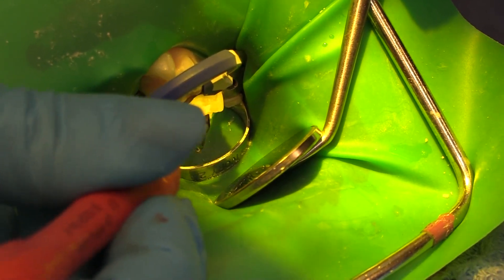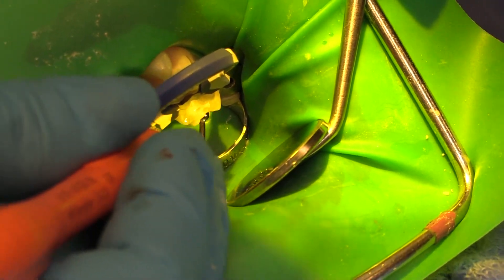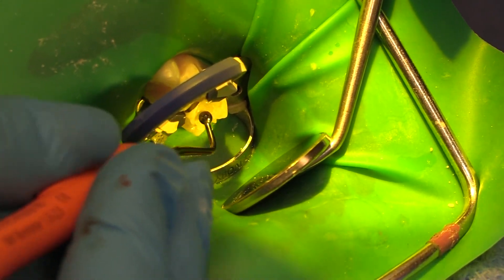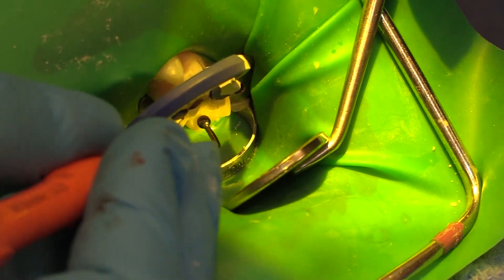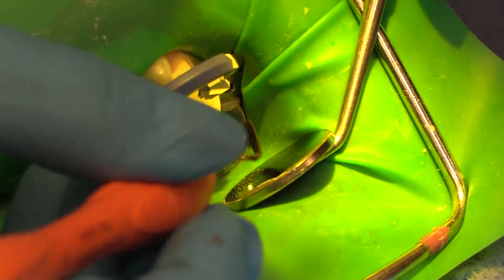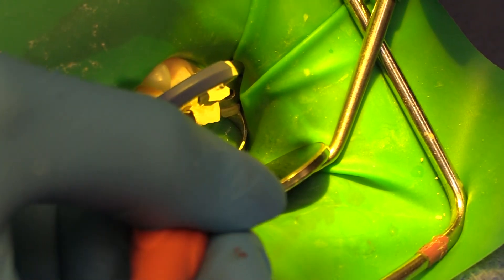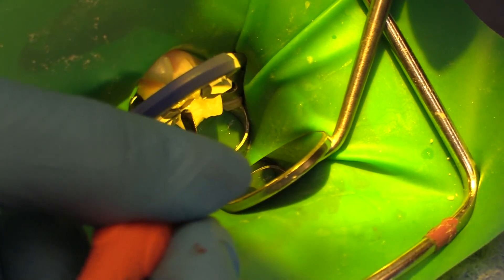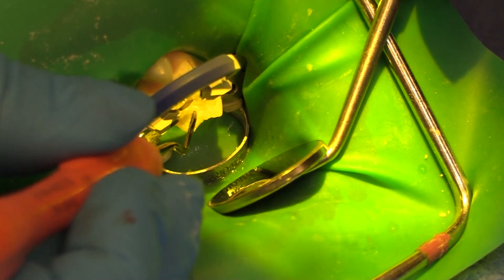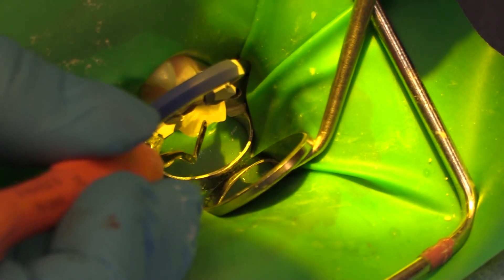Composites in kids need to be conservative. Omni Chroma is a highly filled material and it's quite polishable. I'm not super concerned about polishing for a primary molar restoration — my goal is not to get an accurate life-like anatomy; I'm looking for functional anatomy, something that's smooth and going to last this kid for the rest of the lifespan of the tooth. This kid's about six years old, so we need that restoration in place for about six years until he exfoliates this tooth when he's about twelve. I don't want him coming back with a broken restoration or any issues with this tooth — anatomy is not one of the concerns here.